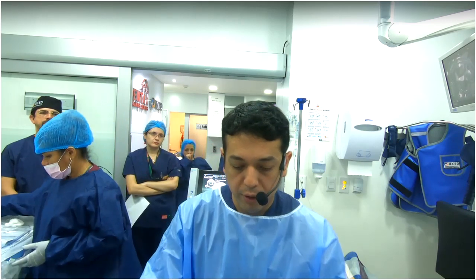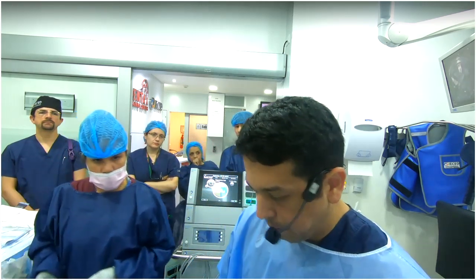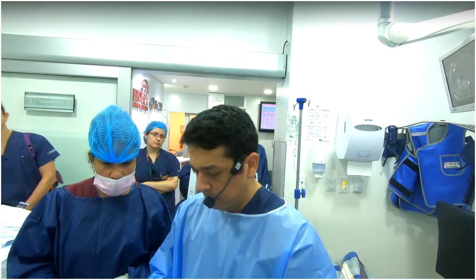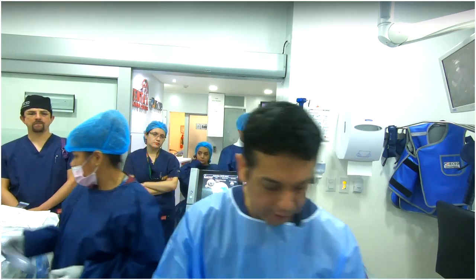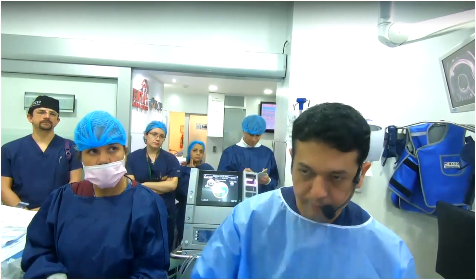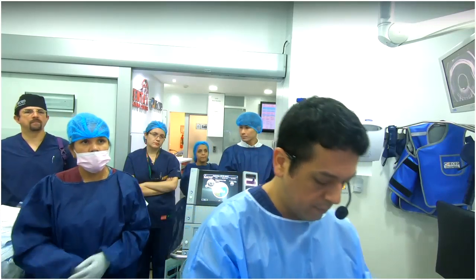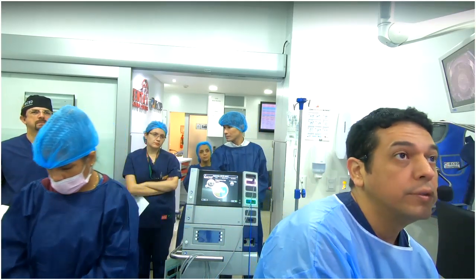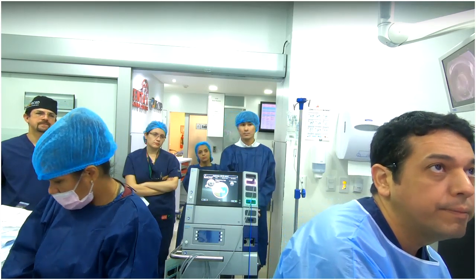And I have very good vision of my area, of my scope vision. Okay, so now we will put the lights. So we will perform the small surgery of this area.